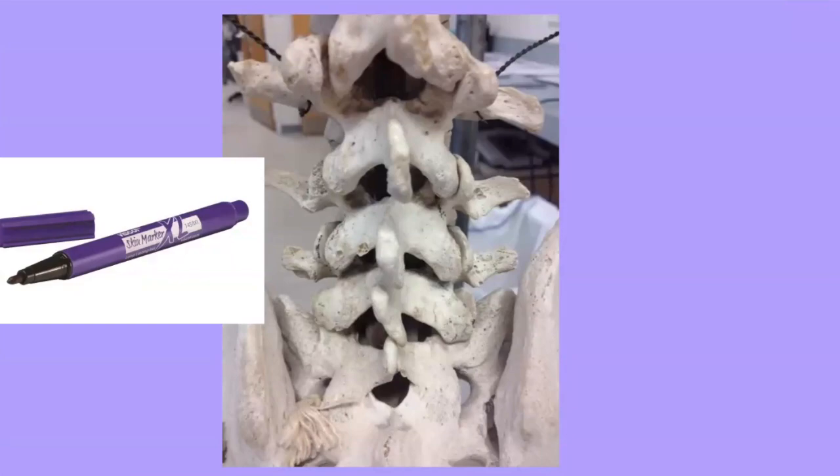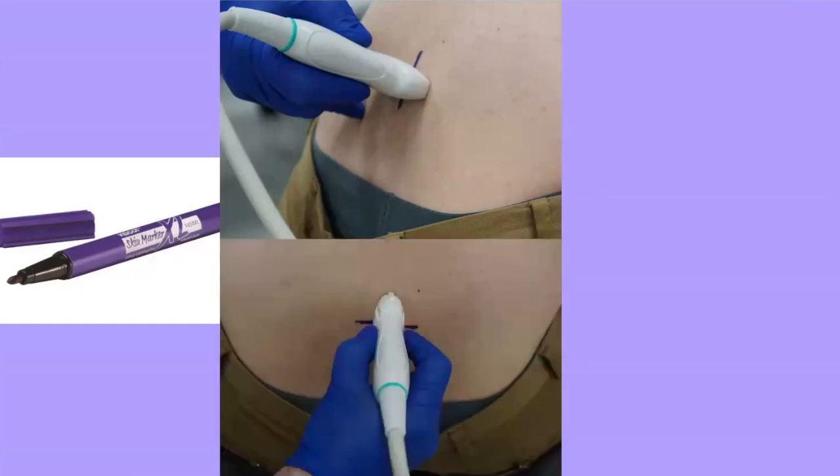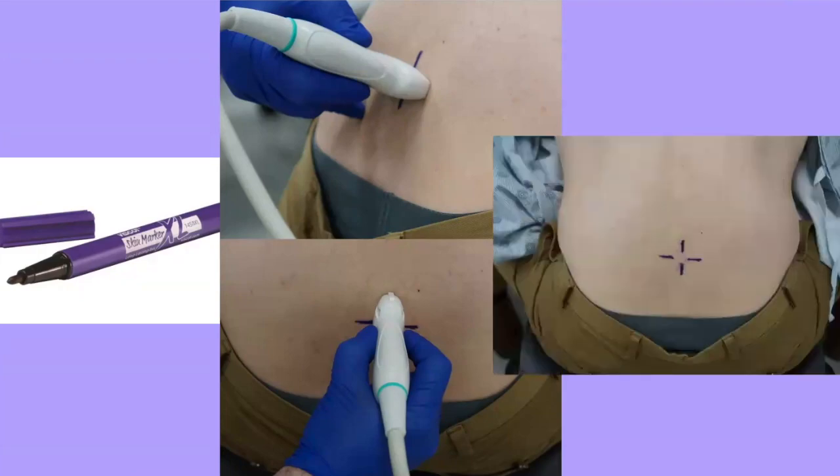This part doesn't need to be sterile, right? So if you're just using whatever pen you have in front of you, that's fine. The reason we want to use a marker, and not, you know, sometimes we MacGyver different ways, like using a cap or suction with a syringe, is that you really want to be able to do the marking because we're doing 2 views with our ultrasound. We're doing transverse and longitudinal, and we're marking at midline. We mark in the transverse position and also the longitudinal position, and you'll see that we just connect the dots and it becomes X marks the spot of where to go.